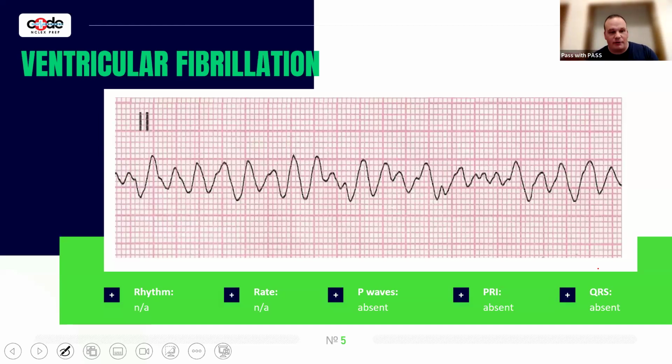So remember, when we go back to atrial fibrillation, I said your atria are just fibrillating, right? Well, in ventricular fibrillation, your ventricles are doing the same exact thing. Now your ventricles are just fibrillating. And when my ventricles are fibrillating, as opposed to having that full contraction and relaxation, I get this squiggly, chaotic waveform.